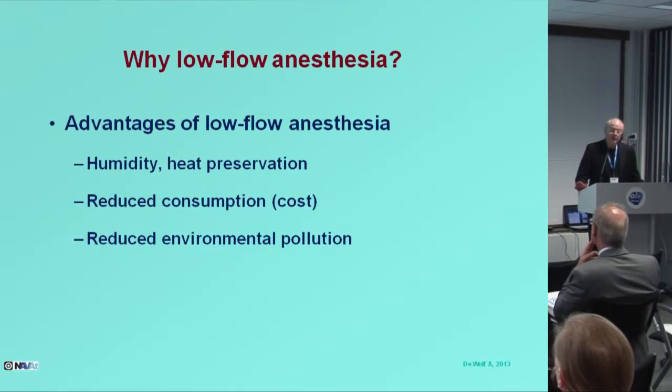So there are several advantages to low flow anesthesia, and I think everybody knows about this. You preserve heat and humidity, and therefore you preserve heat. You reduce the consumption when you use lower flow. You use less of the agent because you re-inhale the exhaled agent. And you reduce the environmental pollution. I think everybody agrees about this, and there is, I think, very little actual discussion about the benefits of all this.